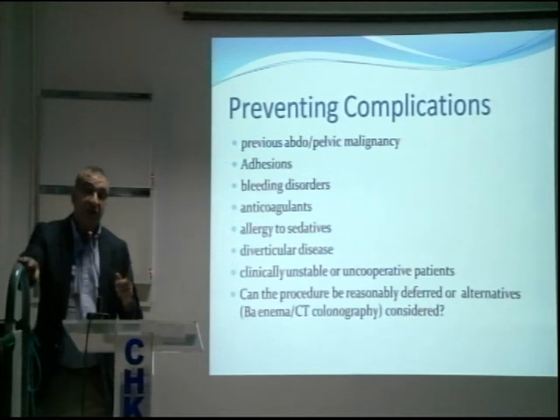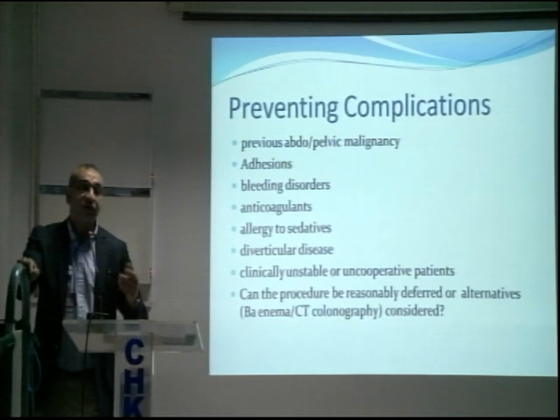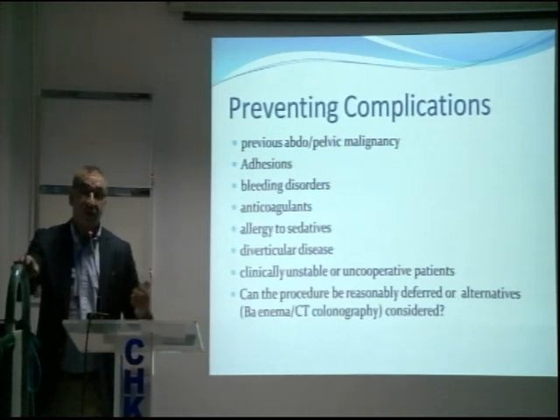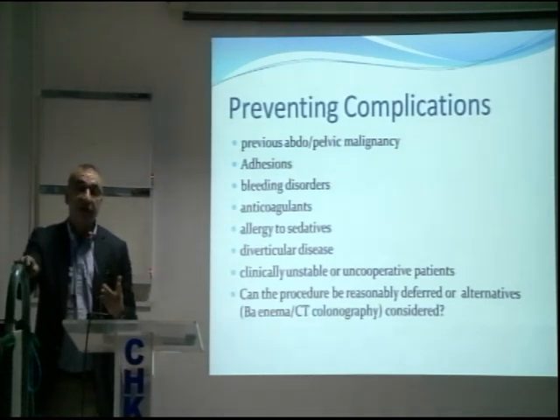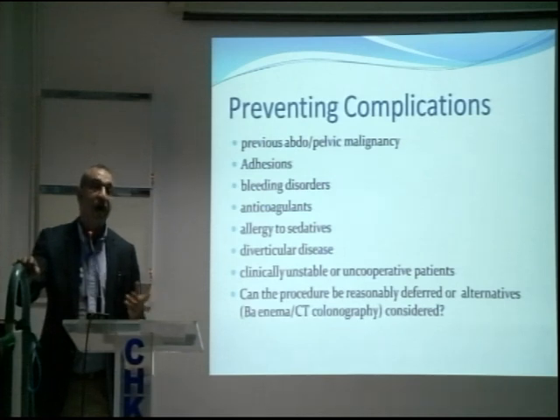People who have had bowel resection, right hemicolectomy, sigmoid colectomy, you would think it would be a piece of cake because the colon is much shorter. But mark my words, those are the most difficult colons because the colon has been manipulated. It is not in its natural position, and those colonoscopies are going to be difficult. So don't think that it's no problem unless he's had a total colectomy. Most of these segmental colectomies are difficult.